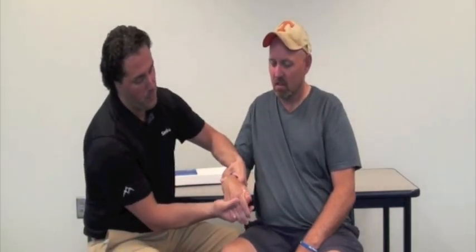Let's test Tony and see if he is a candidate for the Sabo Stretch. We're going to put his wrist in flexion, relax his fingers, and try to stretch them out so they're straight.